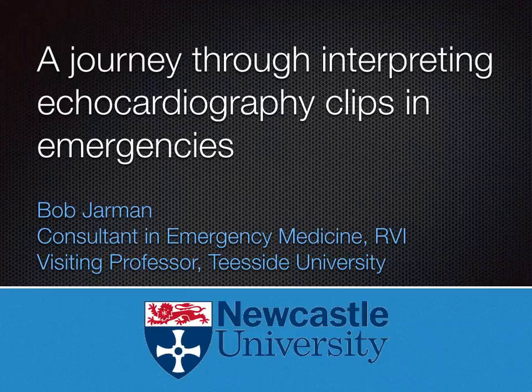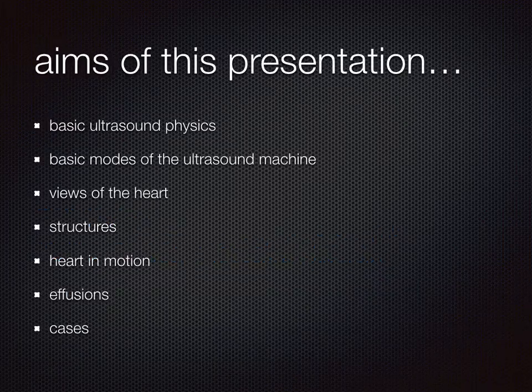Hi, my name is Bob Jarman, and I'm going to take you on a journey through interpreting echocardiography clips in emergencies. These are the aims of the presentation.